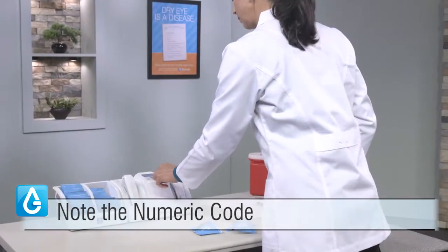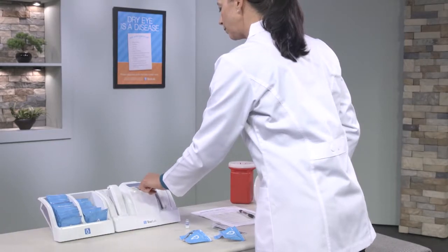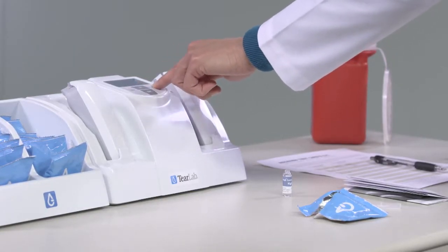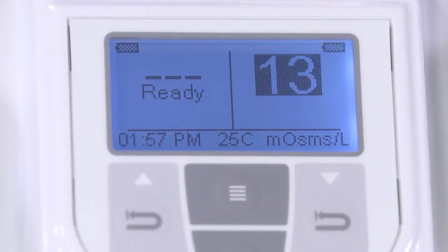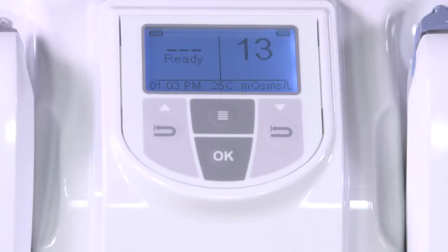Note the numeric code on top of the test card. Within eight seconds, enter the numeric code by pressing either the up or down buttons, which are below the arrow keys on the keypad. When the number on the test card matches the number on the LCD, press OK. When the test is complete, the result will appear on the display.